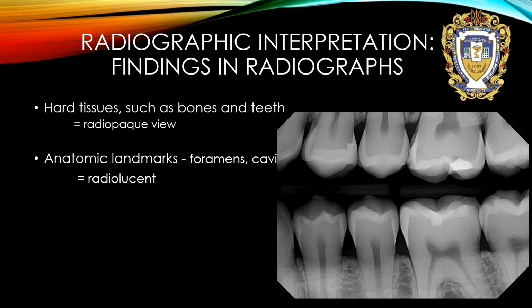For example, the pulp chamber and root canals are radiolucent.